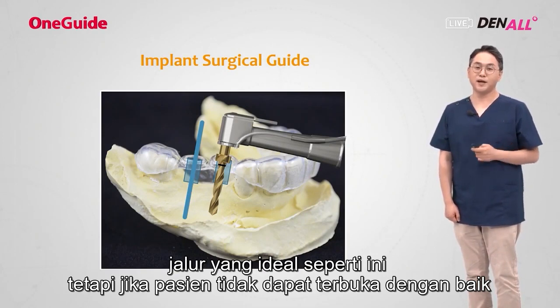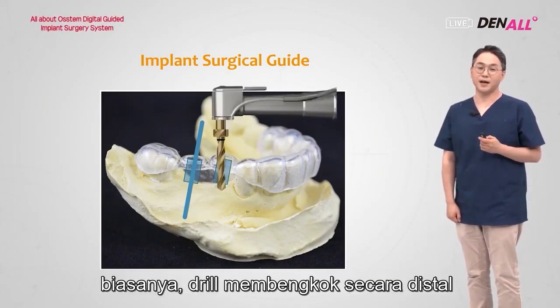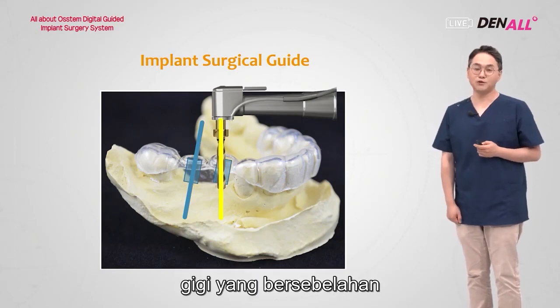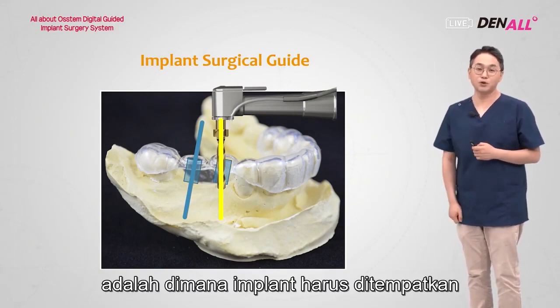Ideal path is like this, but if the patient cannot open very well, or if the surgeon does not have a lot of experience, the drill itself bends. Normally, the drill bends distally, and the apex of the drill heads toward mesially and causes root damage in adjacent teeth. Mesiodistal and buccopalatal good position is where we should place the implant.